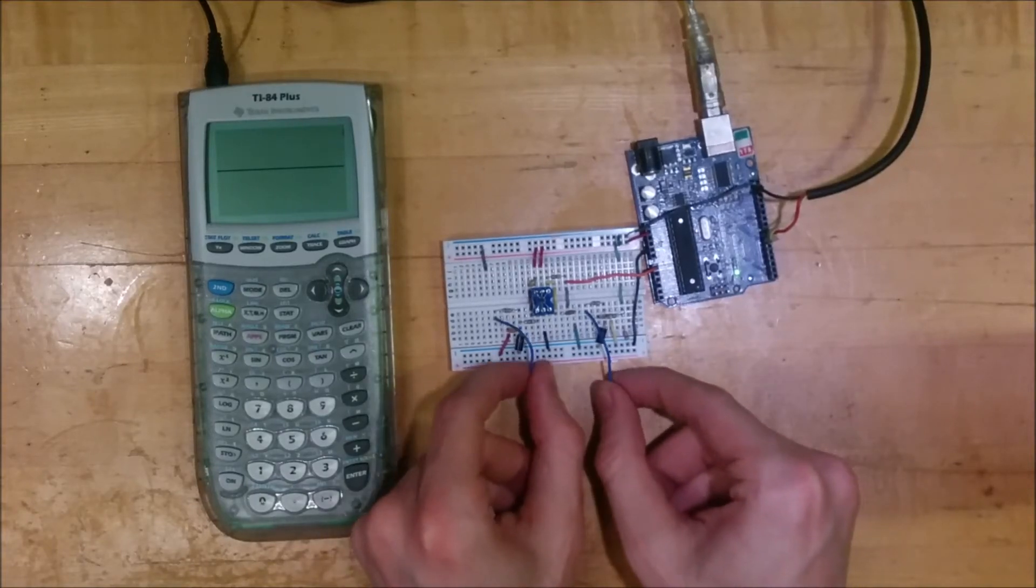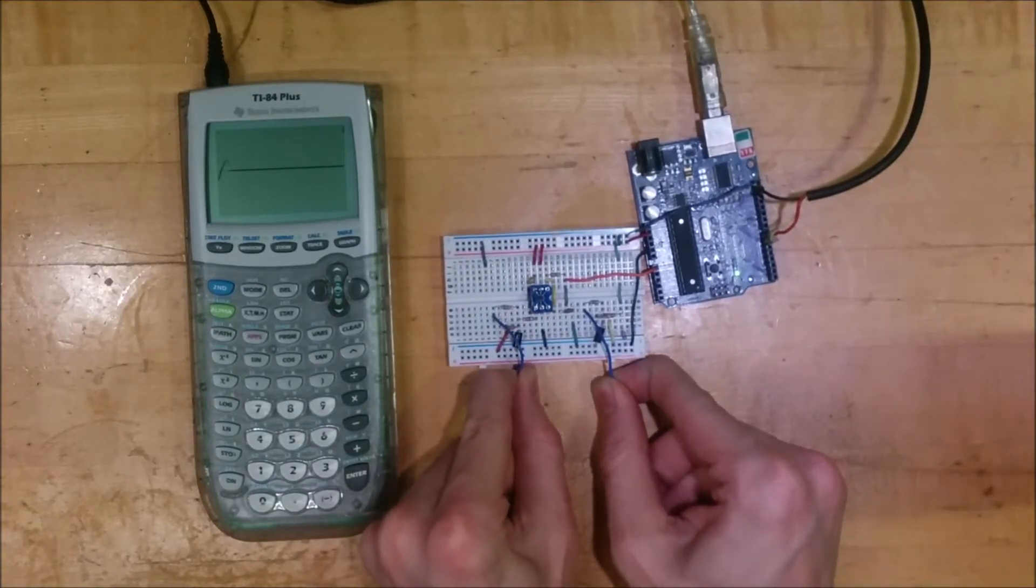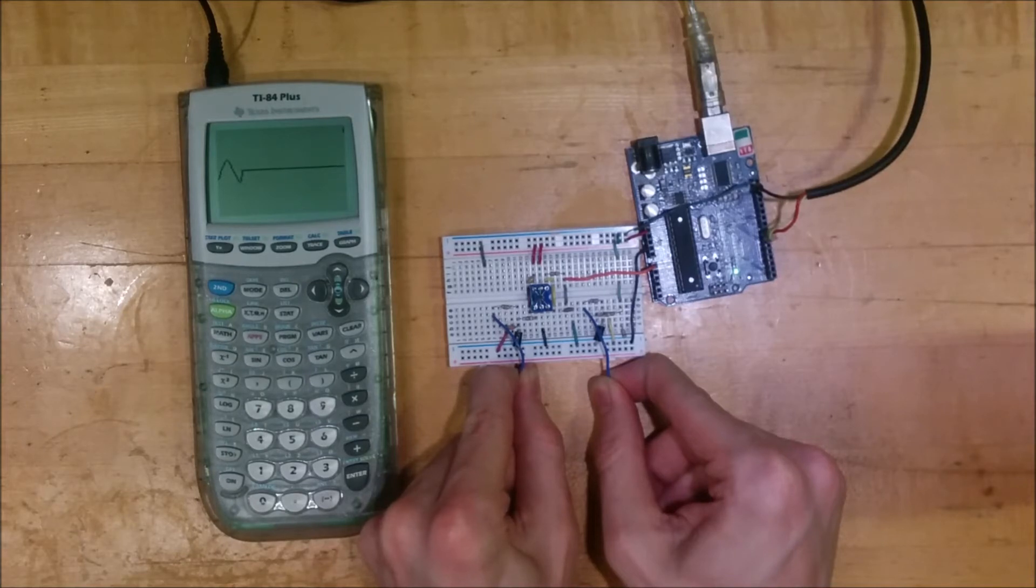If I grasp these two wires here, you'll see that a graph of my heart's electrical signals will appear on the screen of the calculator.